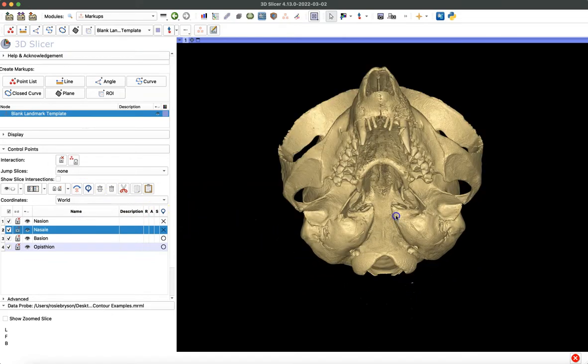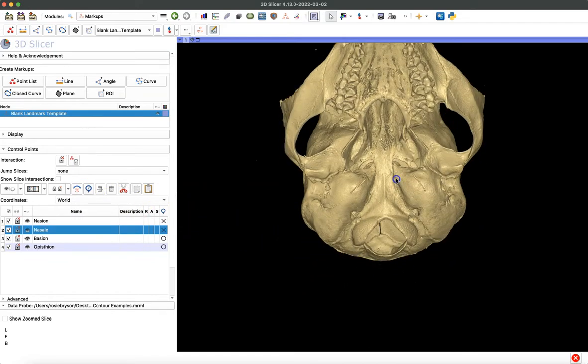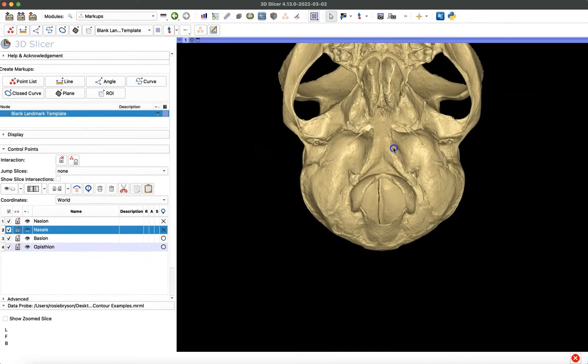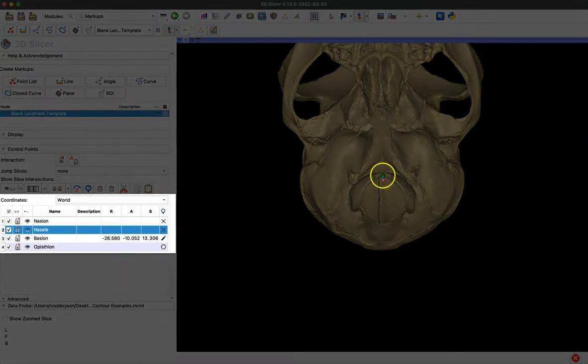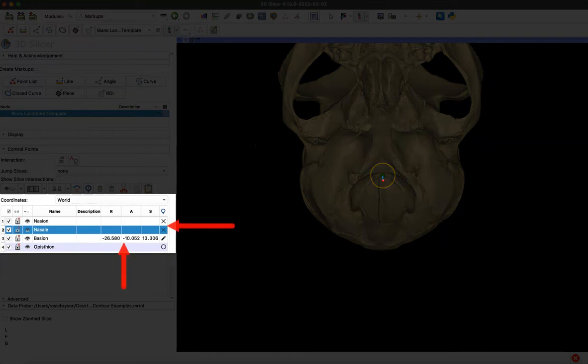Now that I've clicked that, the first place it's going to jump to when I place a point is now basion. You can see those X's next to nasion and nasale. Now when I place a point, I've got data for basion and now opisthion.